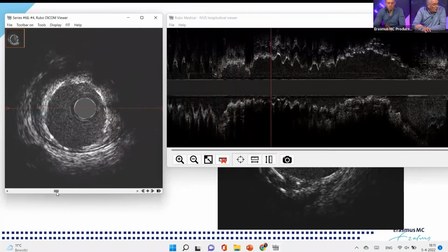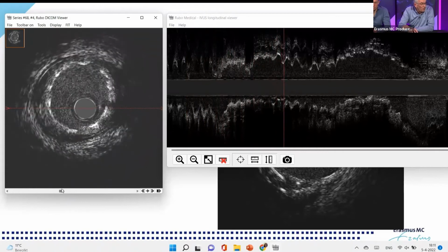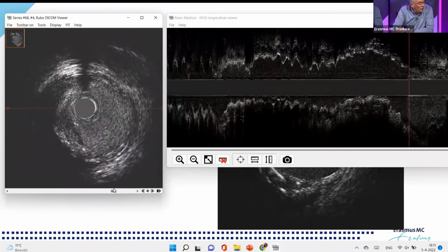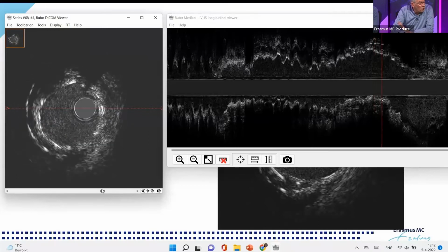Now here we see the part where we had a moderate expansion, not that critical, but the interesting part was around here. And now you see that in the stent in here, there is some material between the old stents, and you never remove the material. You always need room for the hyperplasia of the former stent, but now you see a much better expansion of this new stent in there.